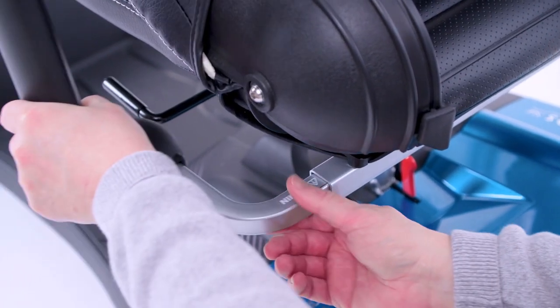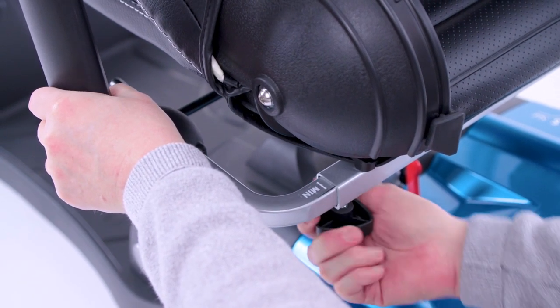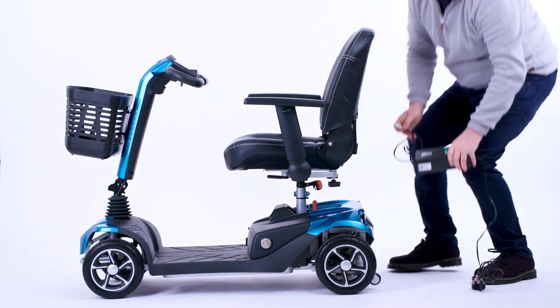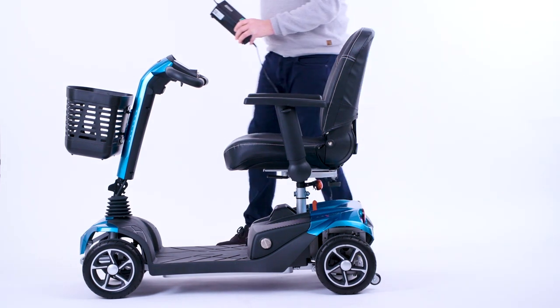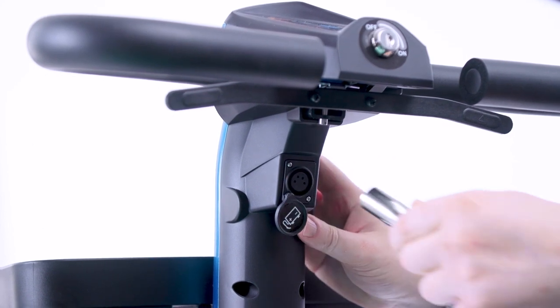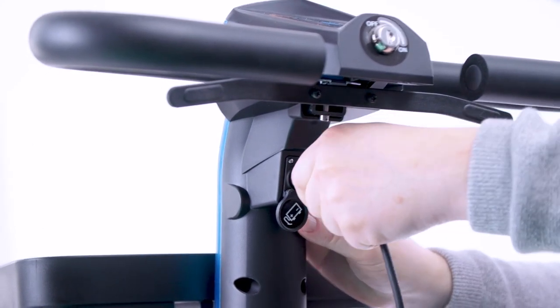Add the armrests to either side of the seat and turn the screws to tighten them. You'll need to place the scooter on charge before its first use. The charging time will be stated in the manual.